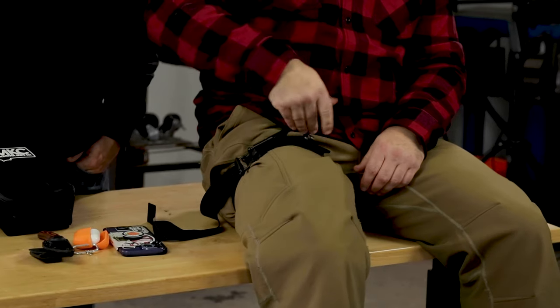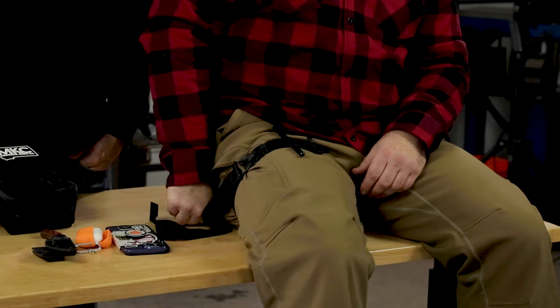That little triangle piece that went over the end — if you're helping get your buddy out, you've put that on his leg, you're going through brush and all that stuff, and if you don't have that done, the windlass can potentially pop out of that little C-clamp. Let's see if I can induce a mechanical failure here. So we're going down the mountain, sticks are hitting, things like that — and now my guy's bleeding to death again and nobody knows it. If he's not conscious or he's in shock, he could be back there bleeding while you're working to save his life.